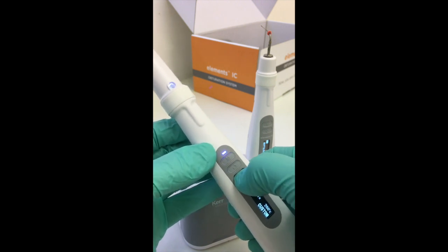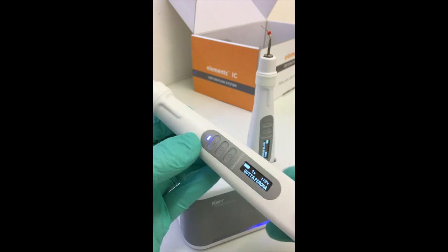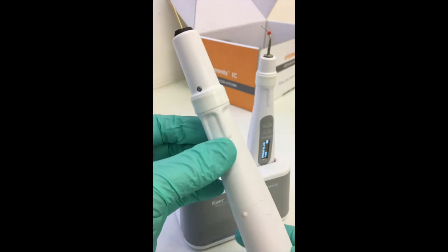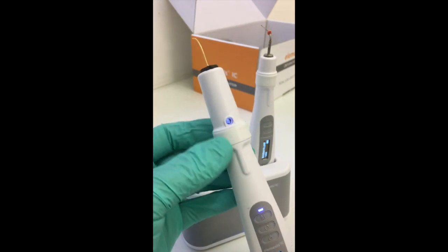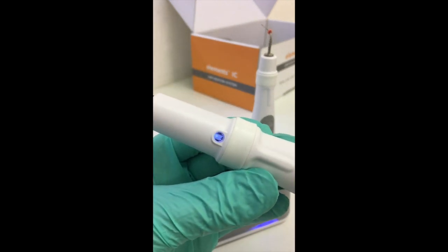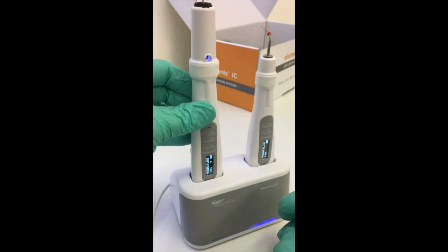Here we can adjust from custom to the guttapercha setting and increase or reduce the temperature. The flashing light indicates the unit is coming up to full temperature, and once it's ready to activate, two presses on the 360-degree touch controller will activate the unit.